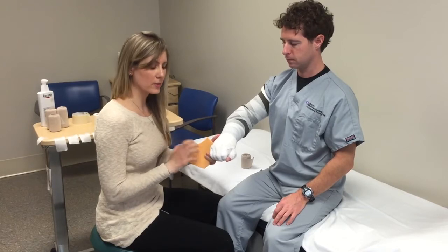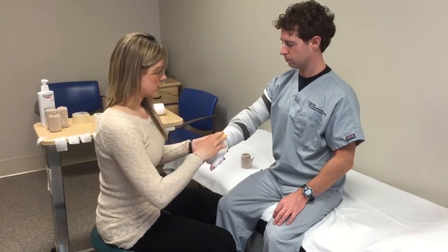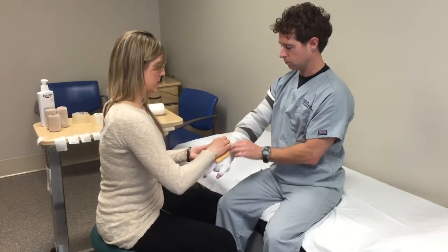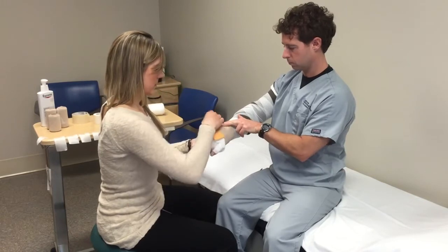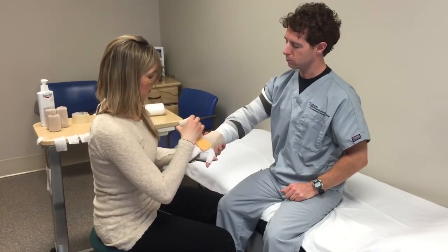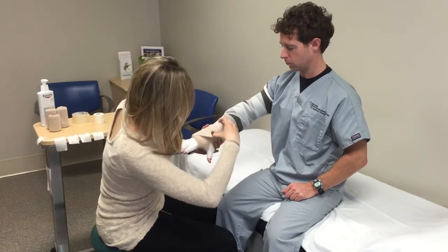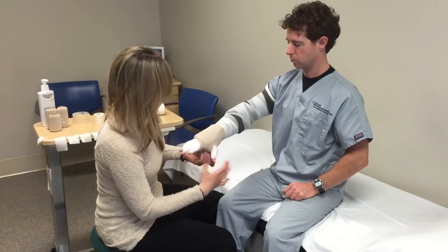It's time to apply the foam piece. Make sure the foam doesn't go down so far that it's on the fingers, and secure it with your first small bandage starting at the wrist. You can have the patient help you a little bit, pulling down and smoothing as you go. Come down and cover the foam, go under the thumb, back above the thumb, and then across the palm. Repeat this for several turns until you've used up your bandage.